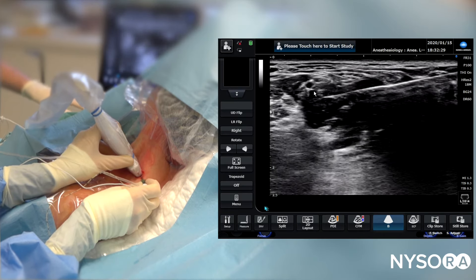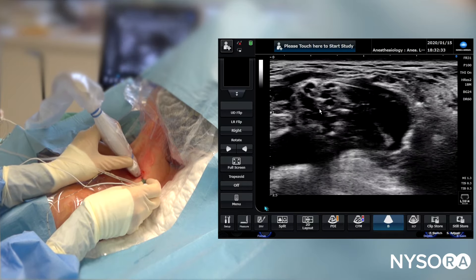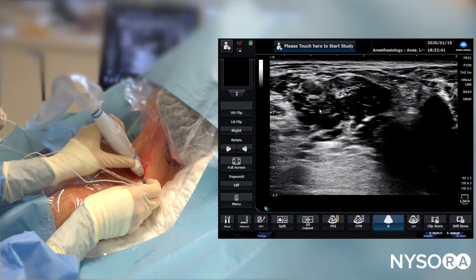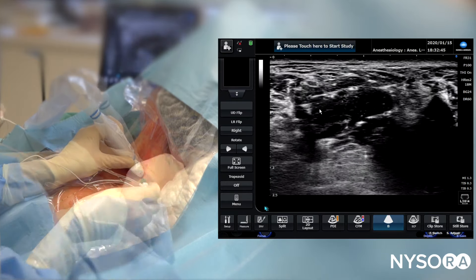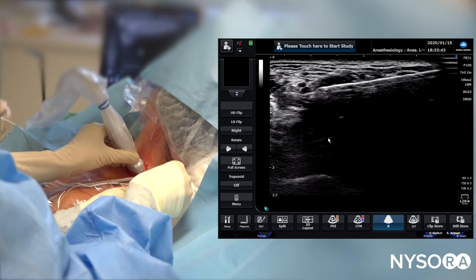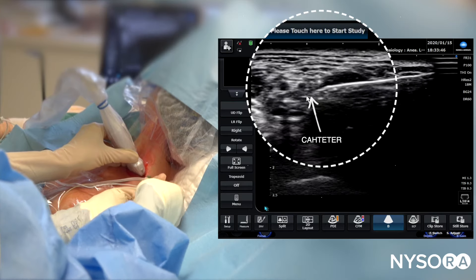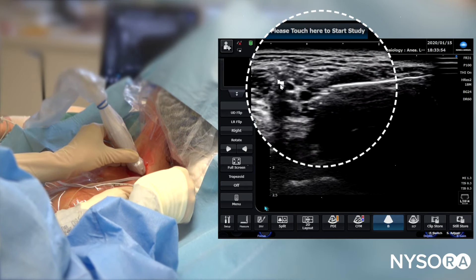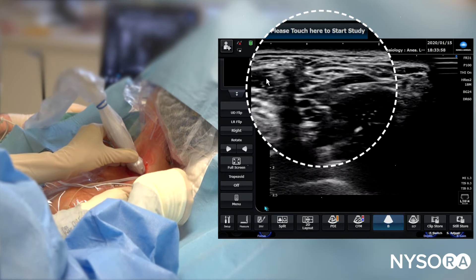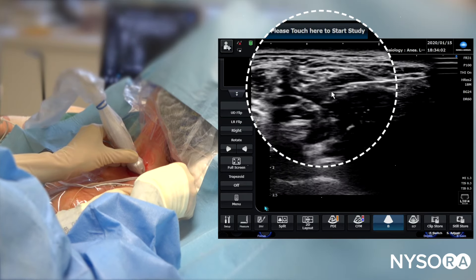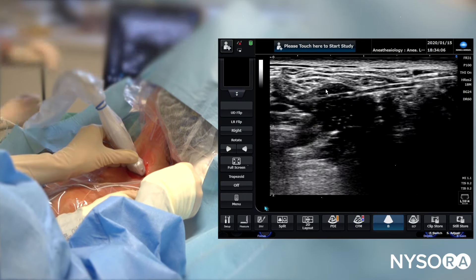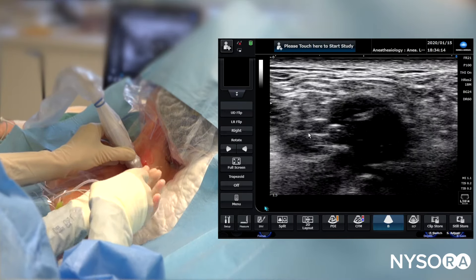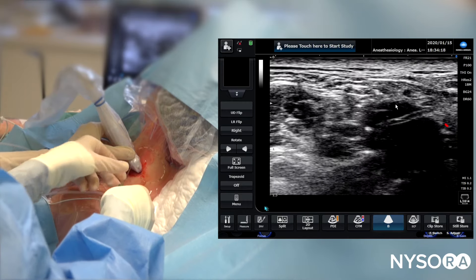You can see how the local anesthetic injection basically separates the brachial plexus elements. At this point we're going to insert the catheter. That's the catheter tip now exiting the needle. As the catheter exits the needle it tends to push the brachial plexus, so we want to avoid the catheter going through the anterior scalene muscle. We start withdrawing the needle slowly while advancing the catheter. Decreasing the depth, we can see the needle track, the catheter, and the brachial plexus.